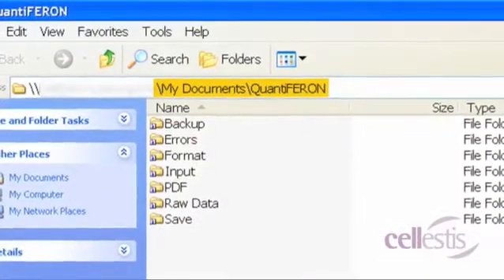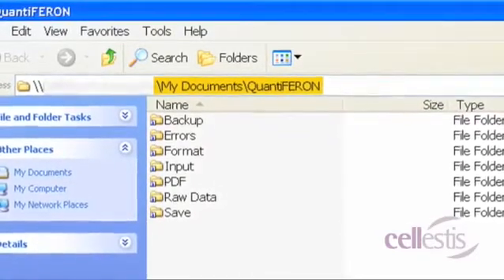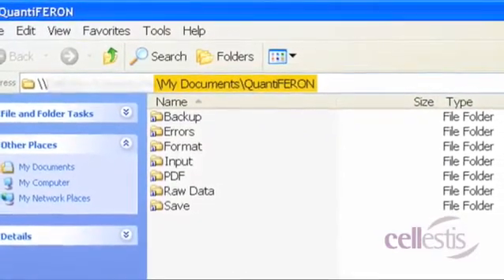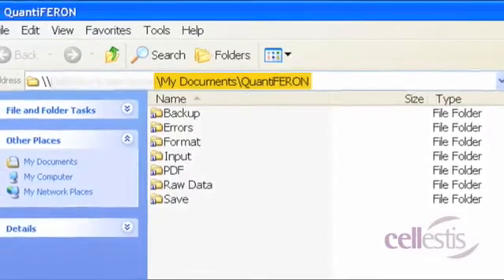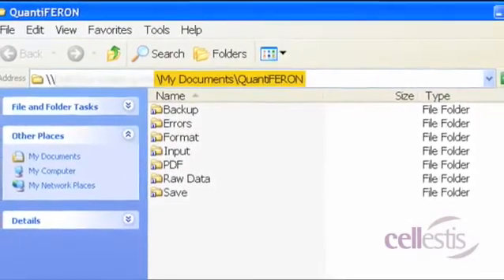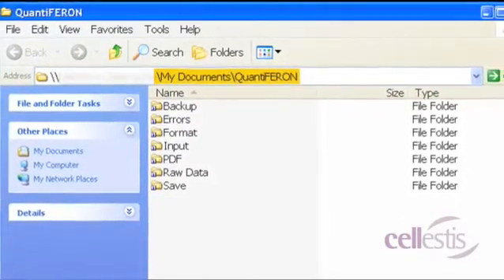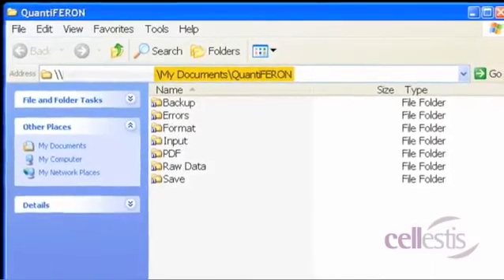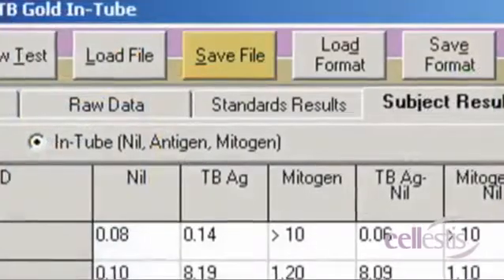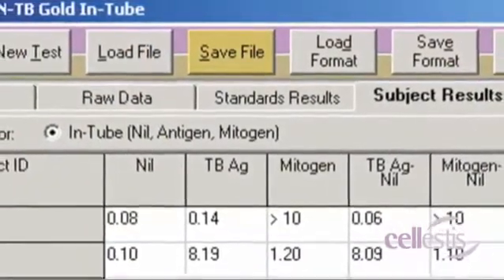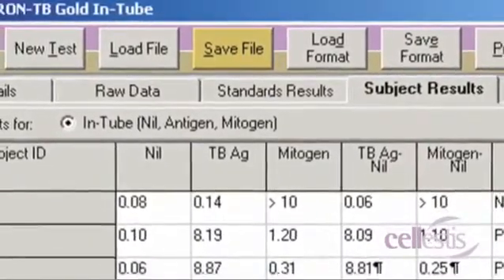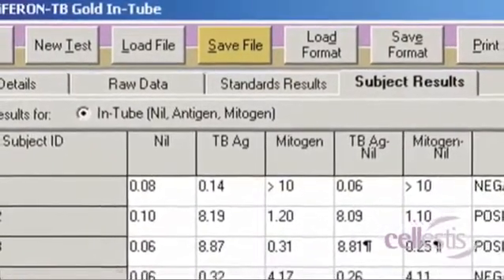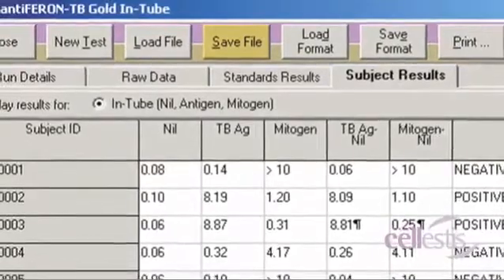Upon opening the QFT analysis software for the first time, a folder called My Documents slash QuantiFERON is created. By default, all files are saved to subfolders within this folder. Select the Save File button to save a copy of the results to file. This can be reloaded for further analysis.